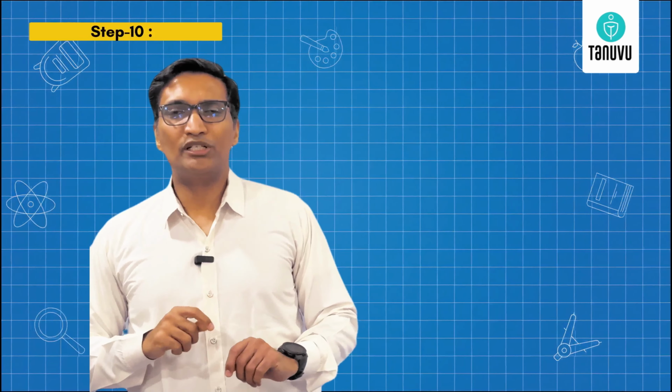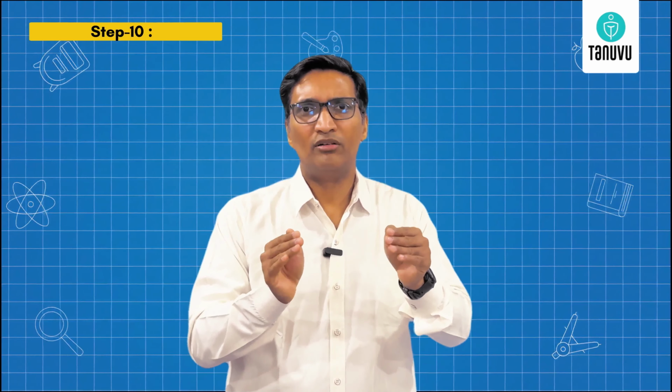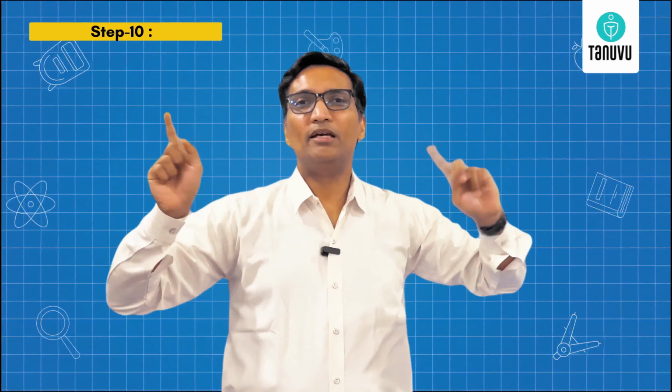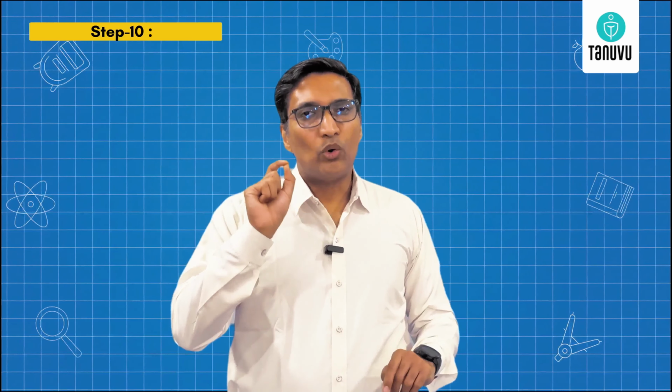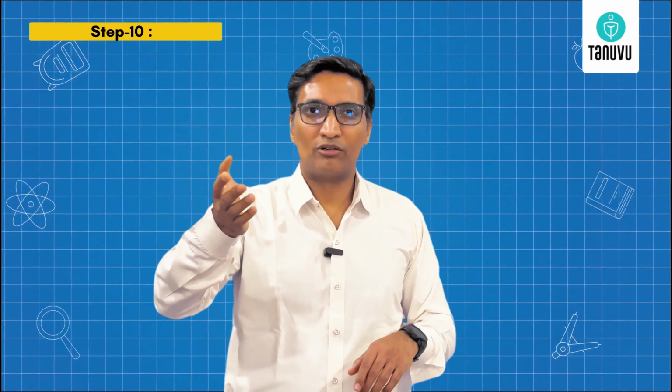However, there are some situations where AVR is positive. So first, when you look at an ECG, look at AVR. If it is positive, that means there is something wrong. The most common reason is that the technician has wrongly connected the right lead towards the left and left towards the right. So picking this up is very important. The only other situation where this phenomenon can occur is dextrocardia. This is quite uncommon, but if you pick it up, you're one in thousands of those doctors who have identified this situation in your patient.